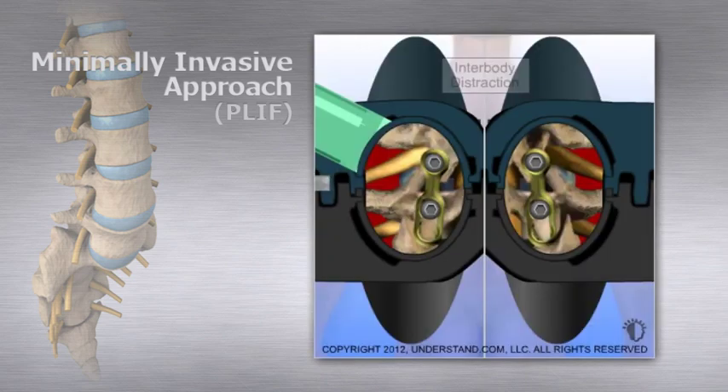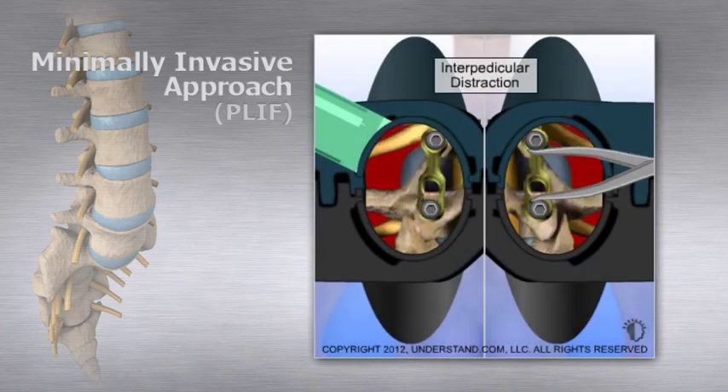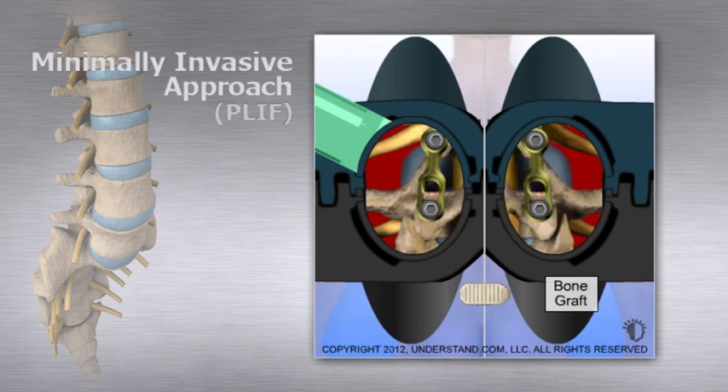To prepare for bone graft insertion, the disc space is spread apart — distracted — by moving the vertebral bodies or applying pressure on the pedicle screws. The screws are tightened to hold the disc space in this open position. Two bone grafts are then placed between the vertebral bodies.